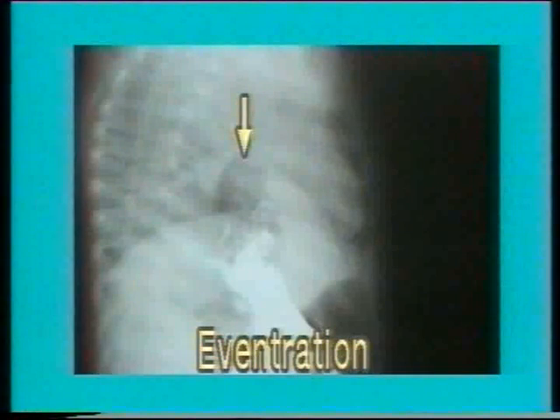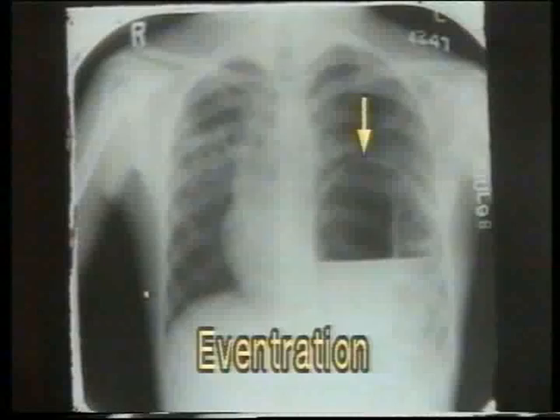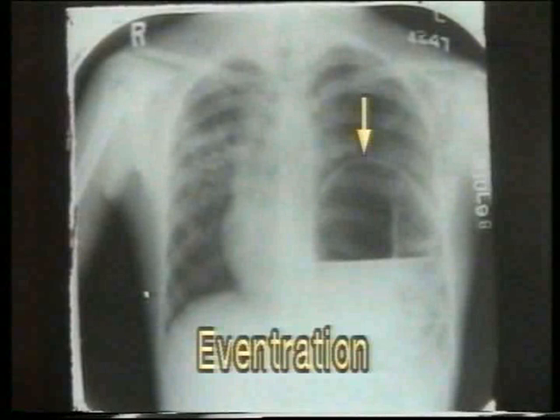In case of doubt, to rule out a lung abscess or a subphrenic abscess, a barium study should be done to demonstrate that the bowels are lying under the raised diaphragm. Eventration is often asymptomatic and may be detected later in life.